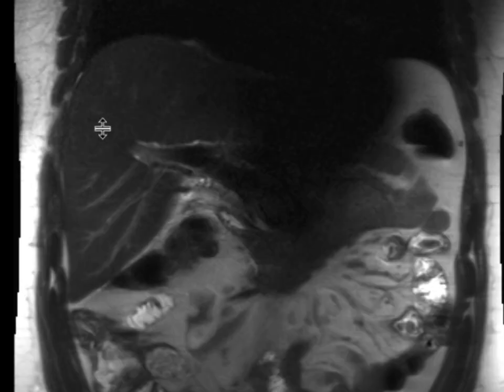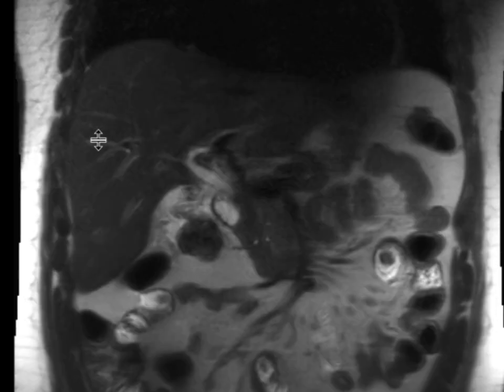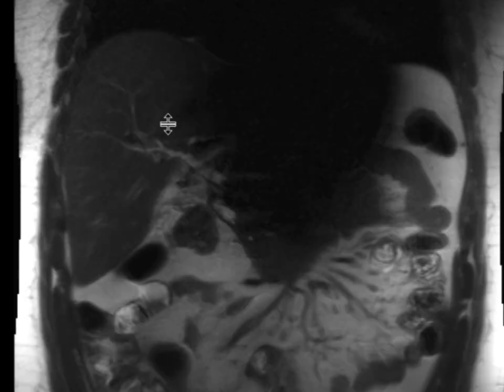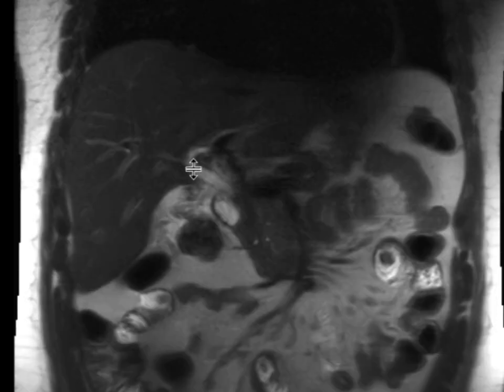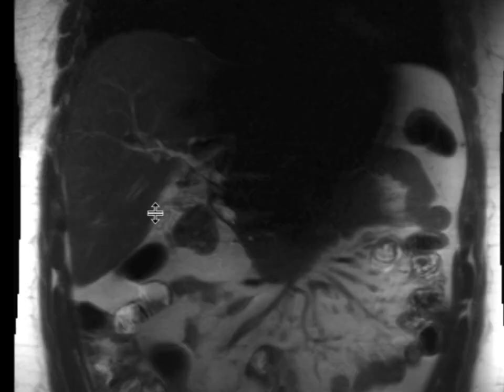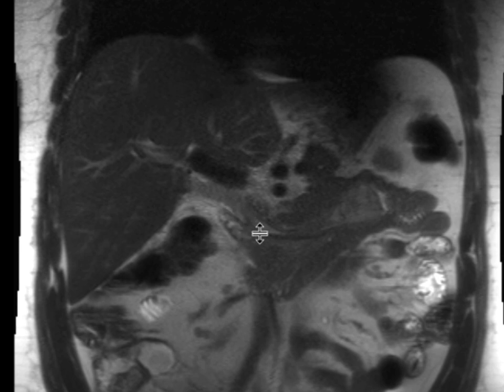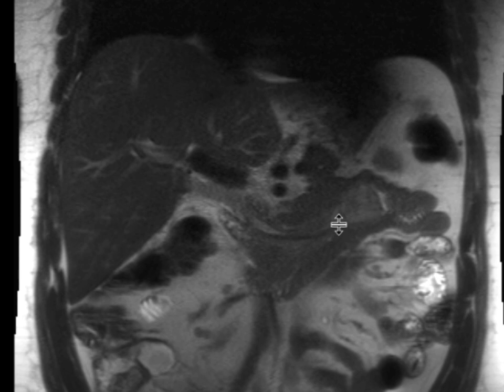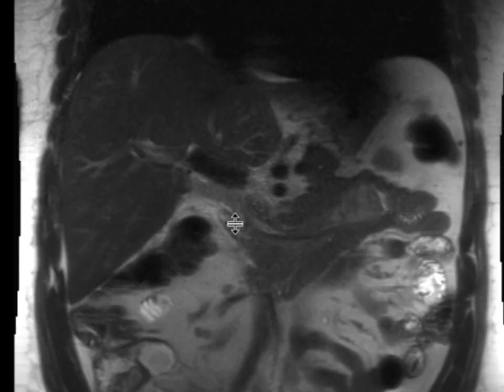We got an MRI, and on the MRI you can see there's a little bit of artifact, but if you follow the common bile duct, you can see it over here. And right around here you can see that it is indeed being deviated more medially than expected, and it really terminates in this T2 intermediate mass over here.